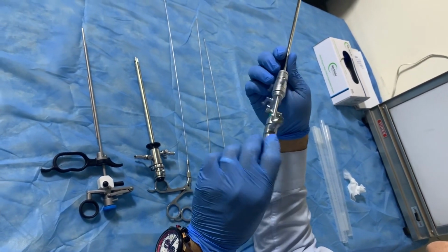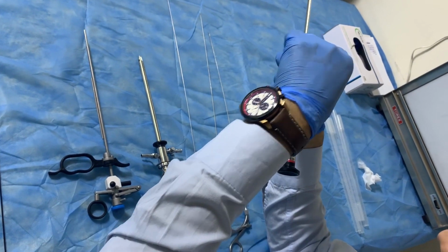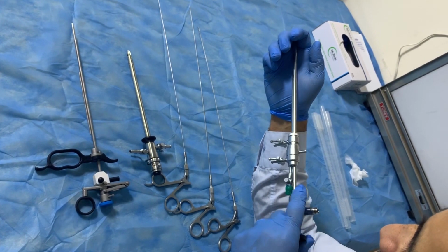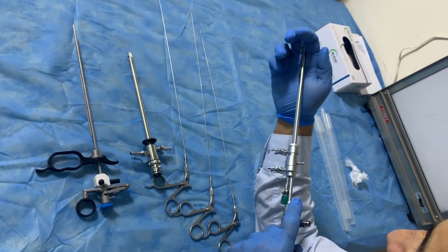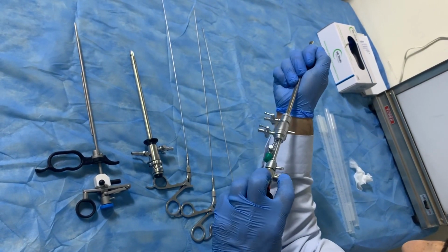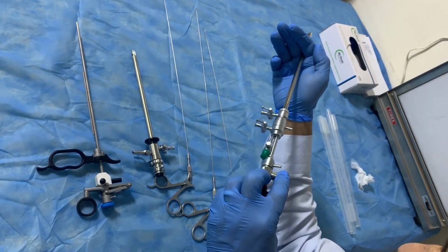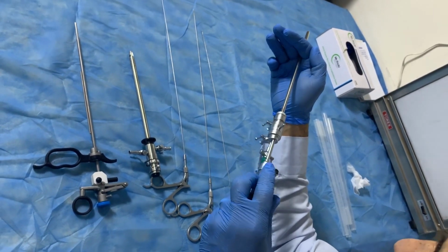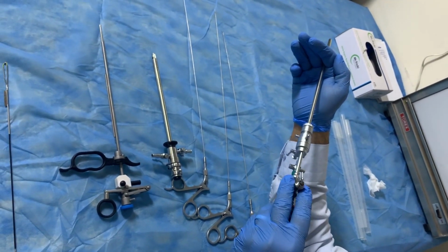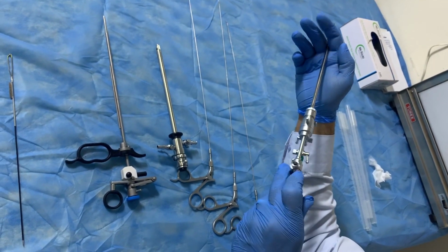After preparing this part, we put the source of glycine here and the discharge here. We put this part inside the vagina, pass it through the cervix and into the uterus. Then turn to the right and to the left from the cable of the camera. If we turn to the right, we see the left side of the uterus. If we turn to the left, we see the right side of the uterus, because we are sitting between the thighs of the patient.